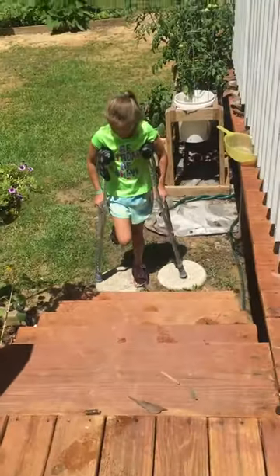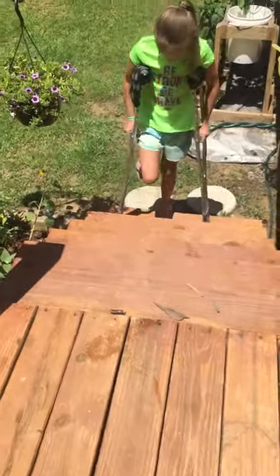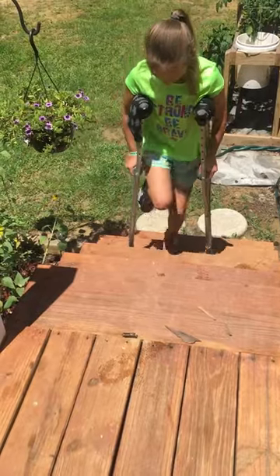And now we're going to go upstairs. Foot first this time — hop with your foot, then you bring up the crutches.